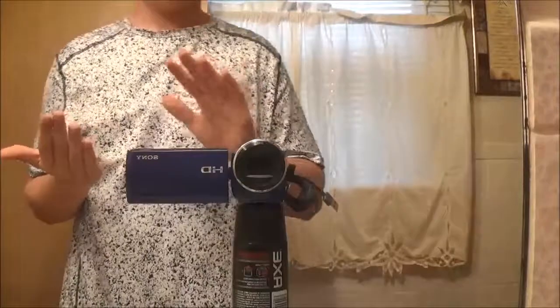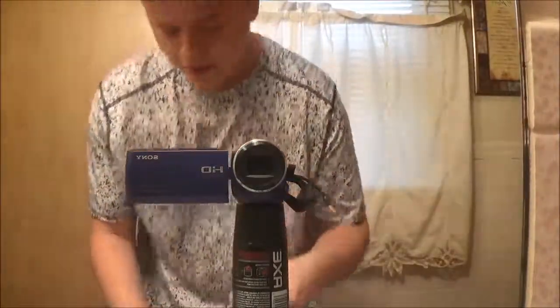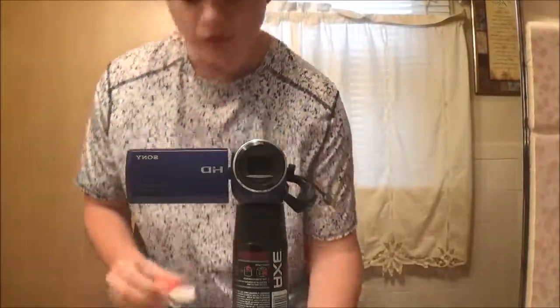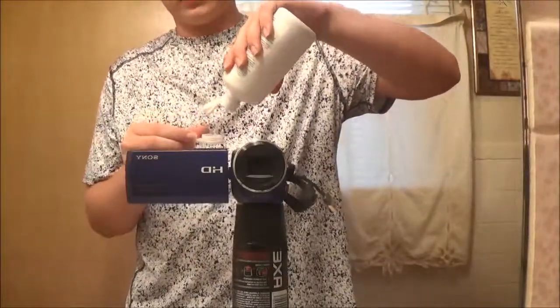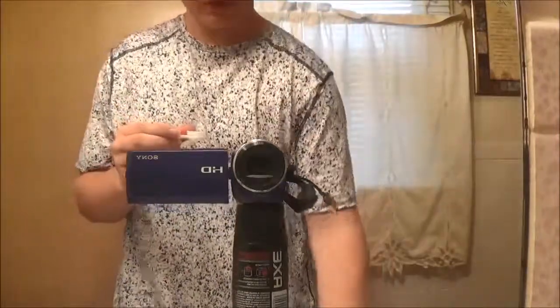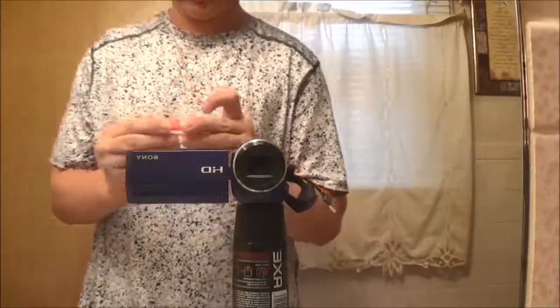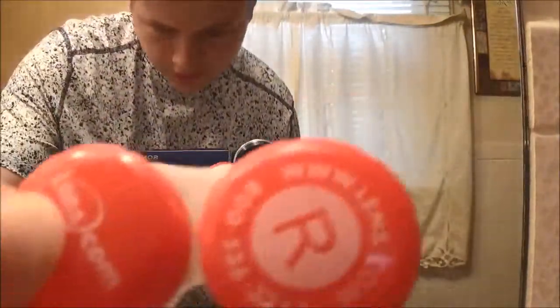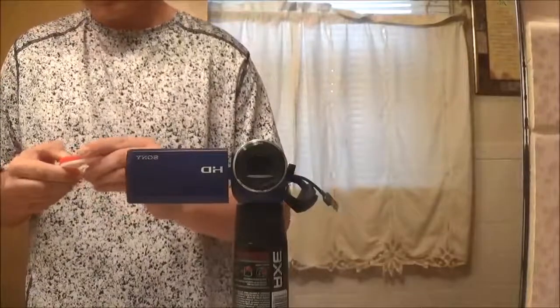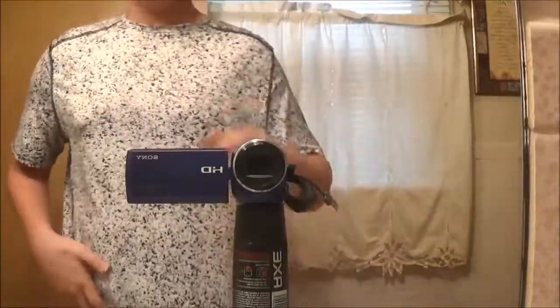I have long fingernails, sorry about that guys, I look like a girl, it's embarrassing. But you want to cut your fingernails so you don't end up ripping the contact. And same process, just fill it full enough, not too full, not too little, but just about right. And you're going to slide the cap on. Now, contact case is on. A little drip there. They're on tight now. And now basically I don't have my glasses on me.